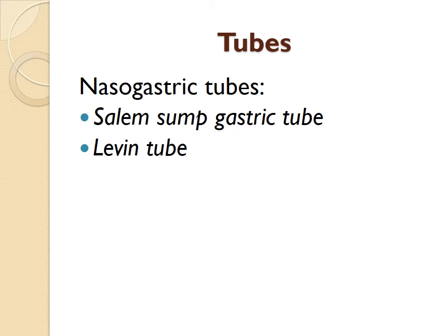The last tube I want to mention is referred to as the Minnesota tube. If the patient does have a Minnesota tube, the difference is only going to be that this tube has a 4th lumen. It is used similar to that Sengstaken-Blakemore. We usually just call it the Blakemore, but it has the added port which allows for suctioning above the esophagus, above that esophageal area. And you'll also see different things referred to as nasoenteric tubes, and they're usually passed down into the small intestine, so therefore they are longer in size.